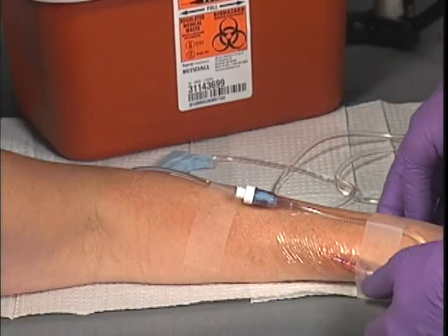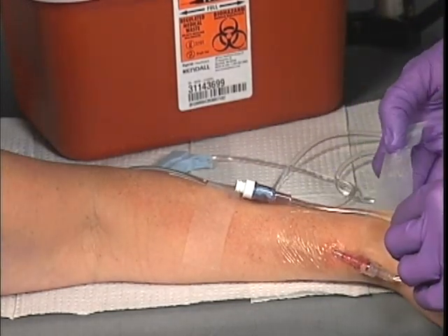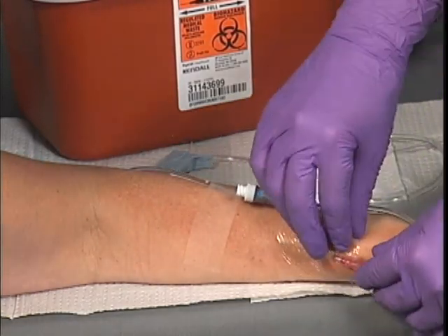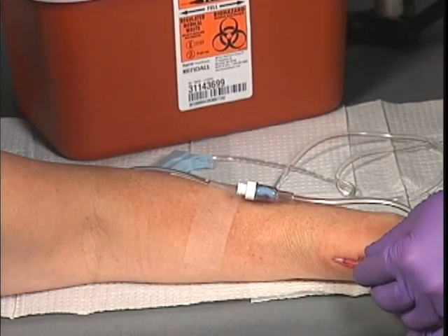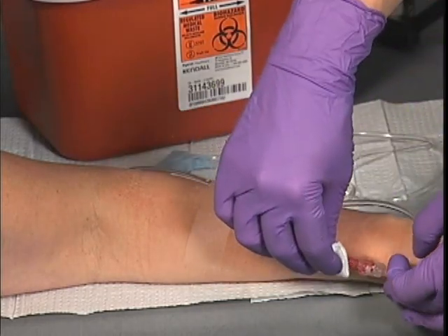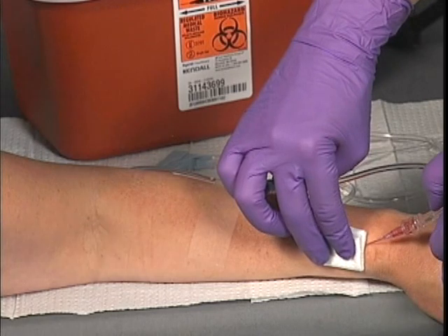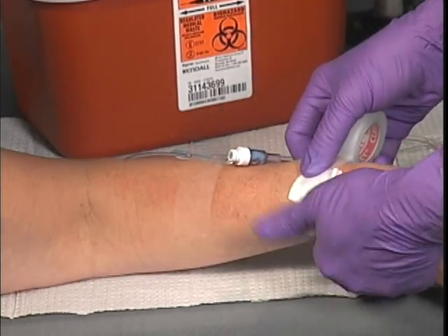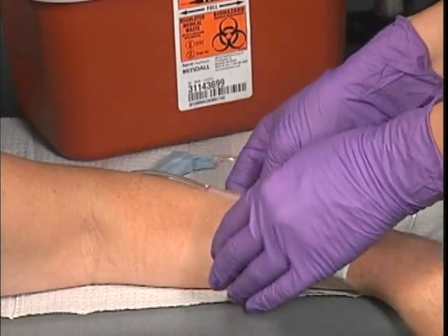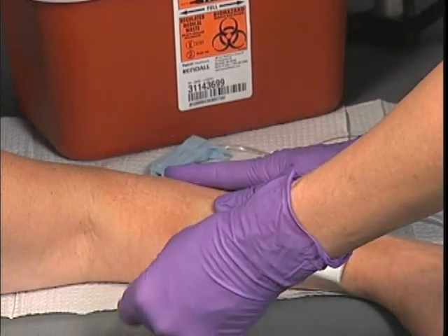When discontinuing an IV, first close the flow clamp of the IV administration set. Gently remove the tape and securing device to expose the venipuncture site. Cover the site with a gauze square and apply gentle pressure as you remove the IV catheter. Inspect the catheter to ensure it is complete, noting any abnormalities. Affix an adhesive bandage to continue applying pressure until bleeding has stopped. Properly dispose of all materials and monitor the venipuncture site for further bleeding before leaving.